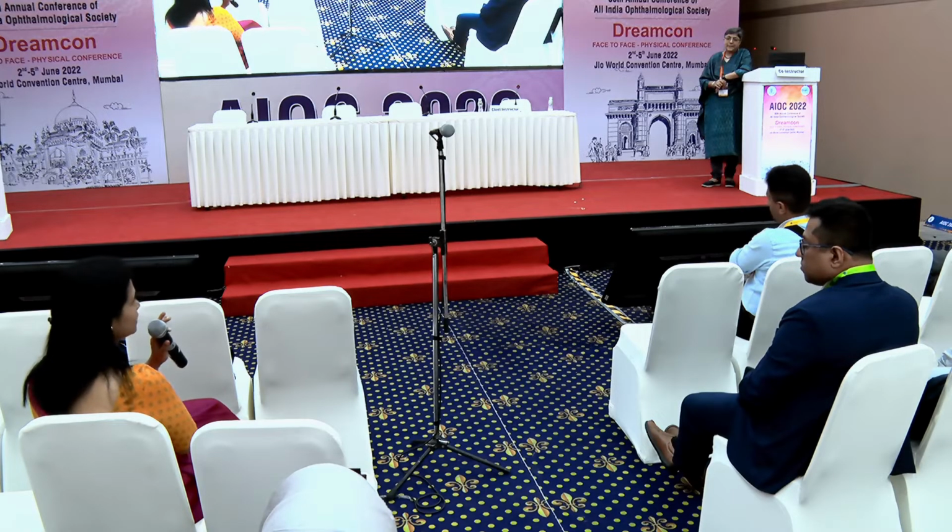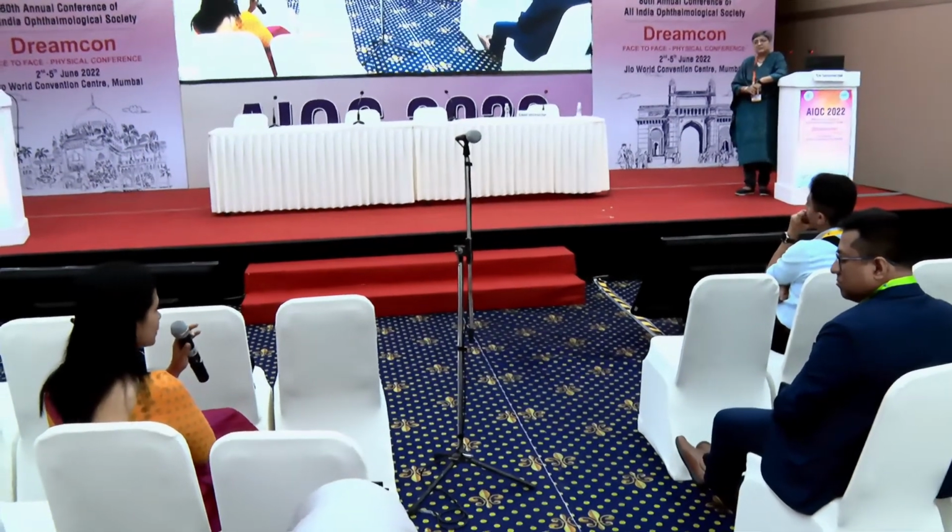Otherwise, many times it's like cornea/glaucoma EUA. You don't know what it is, whether the baby is going to require a surgery, a short anesthesia, long anesthesia, minor OR, major OR. These are issues because they're coming from far away and you need to make a major decision. So we can do it even without anesthesia, with a little bit of restraint, but we should be able to help make a decision at least.